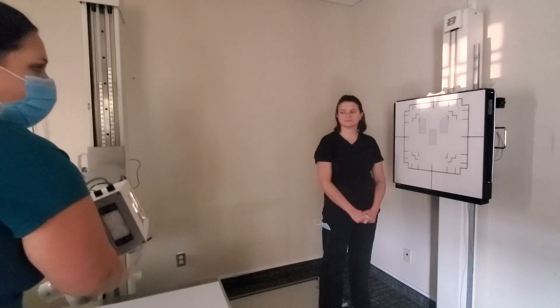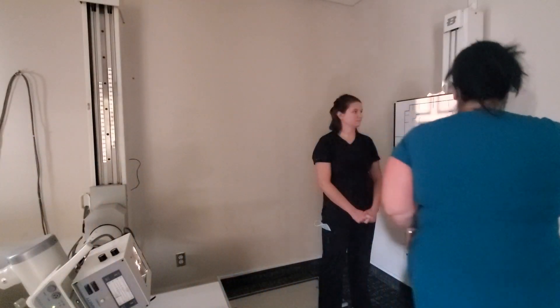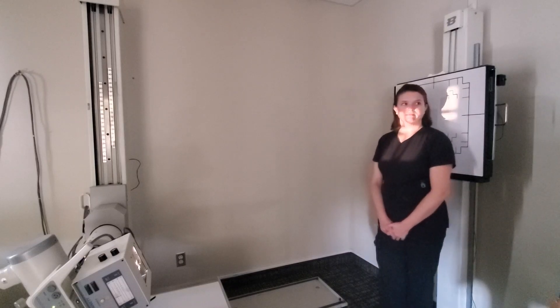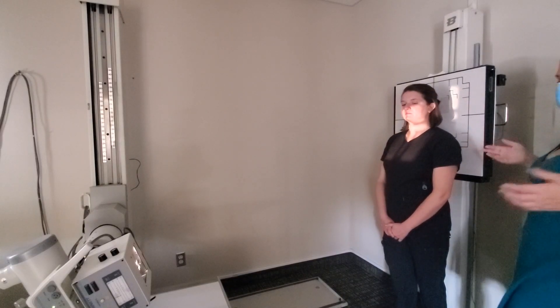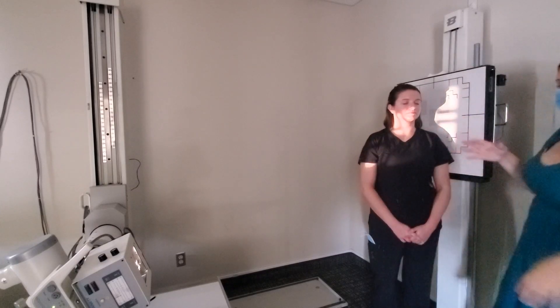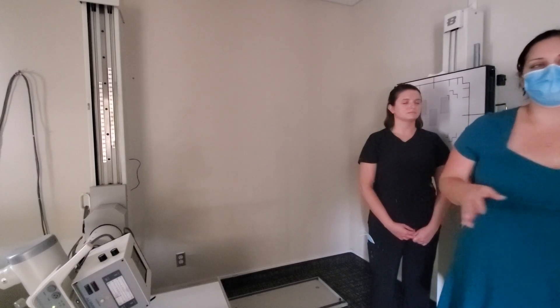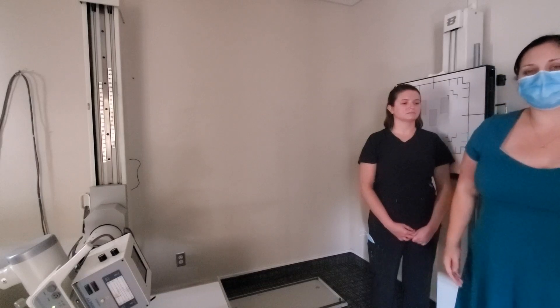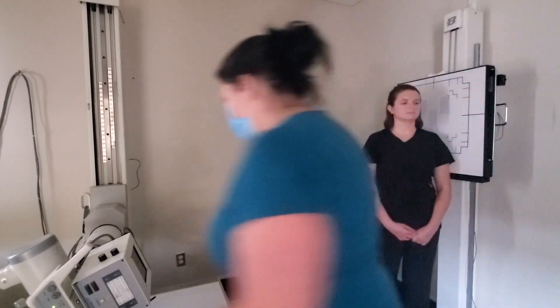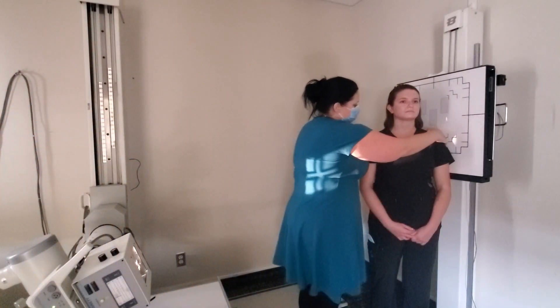I'm going to have my patient come in and start with an LPO since that will be most visible on this video. Rotate your patient 45 degrees and make sure their feet are under their shoulders — if their feet are straight and you turn their upper body, the feet act as a homing plane and they'll rock back toward true AP, so make sure you have that full 45 degree rotation. Centering is still at C4.